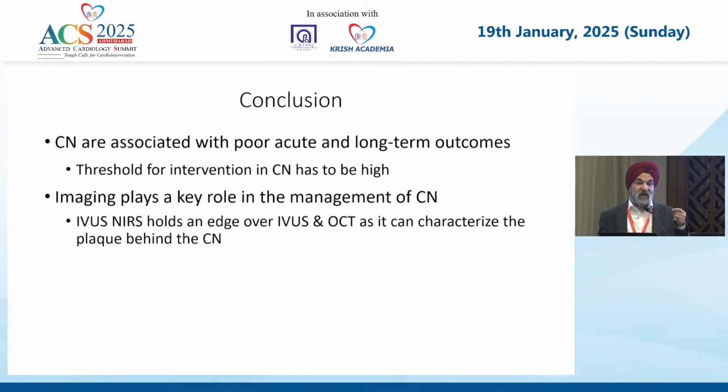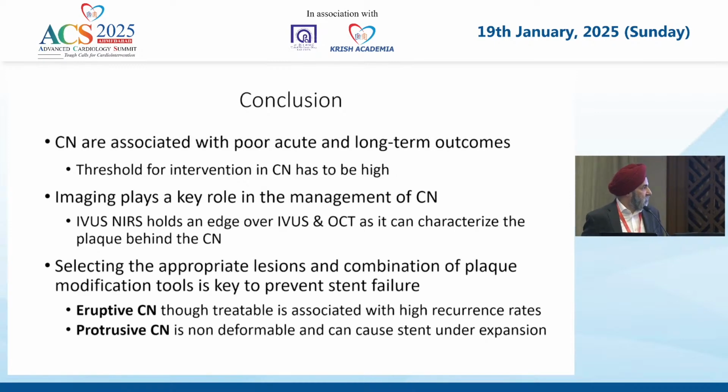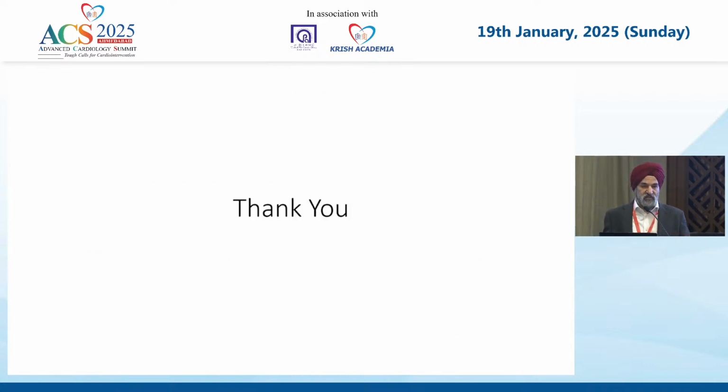That means they have eggshell calcification. That means there is calcium on top, there is lipid core inside and calcium behind, and you can really deform these nodules. Well, you need a combination of tools to use in this setup. As I told you, eruptive nodules are treatable, protrusive nodules are non-deformable, and they can cause stent under expansion. So please be very judicious in your approach towards these lesions.